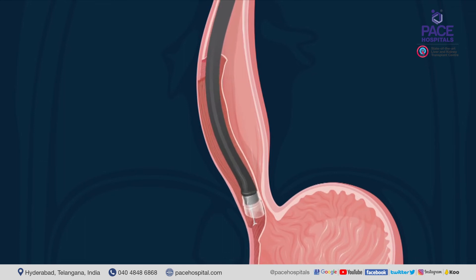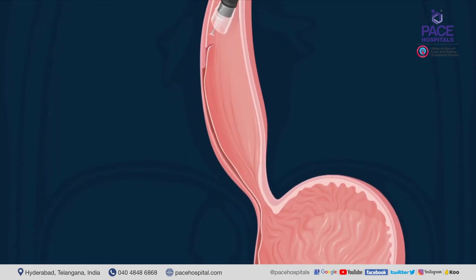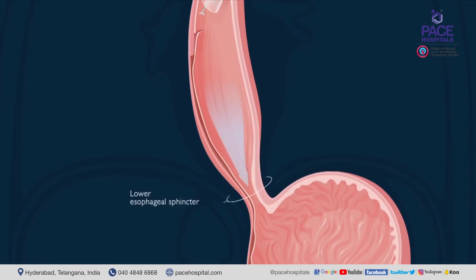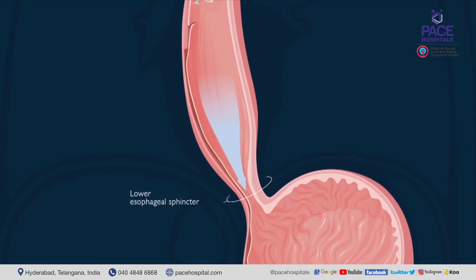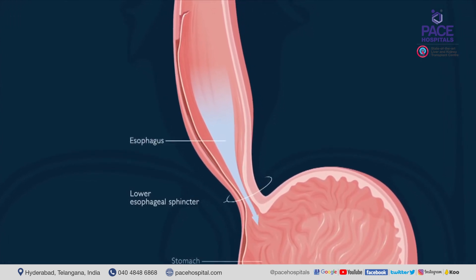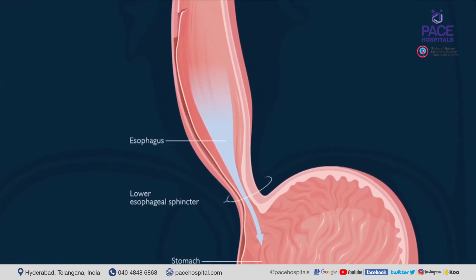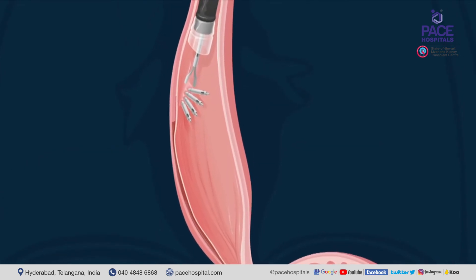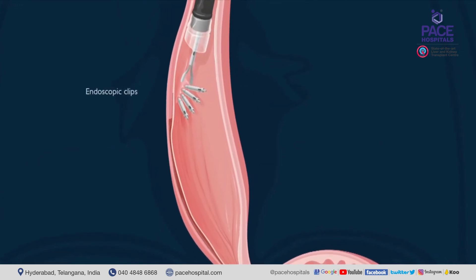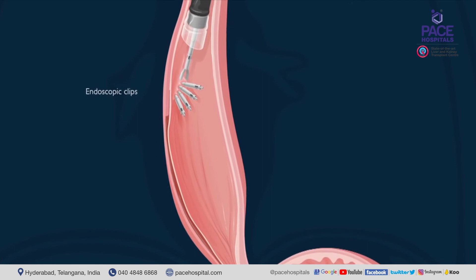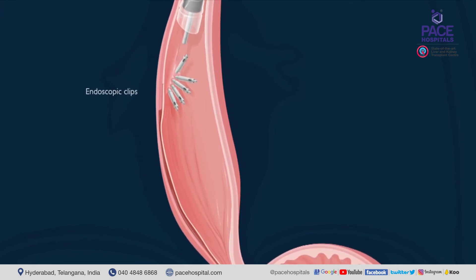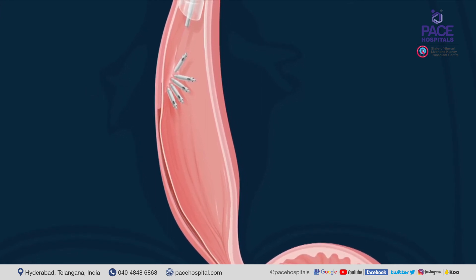This will help in relaxing tightness so that food passes normally to the stomach and the esophagus empties as before. The esophageal incision is then closed with standard endoscopic clips.